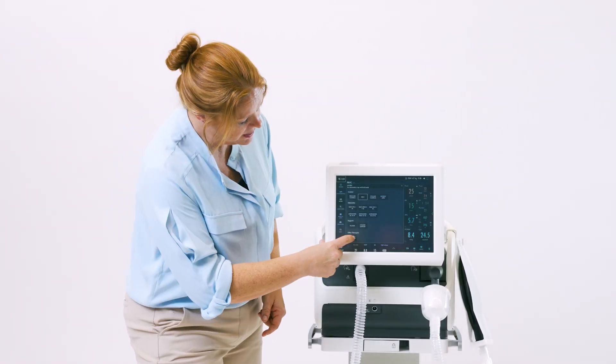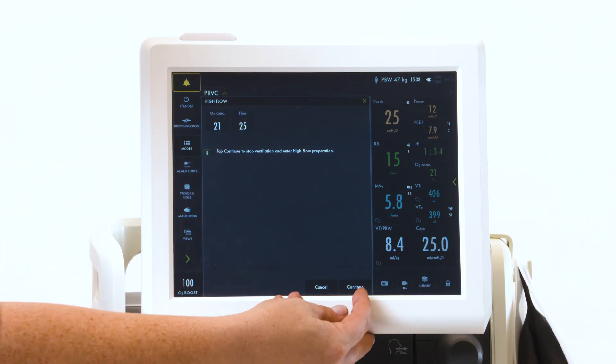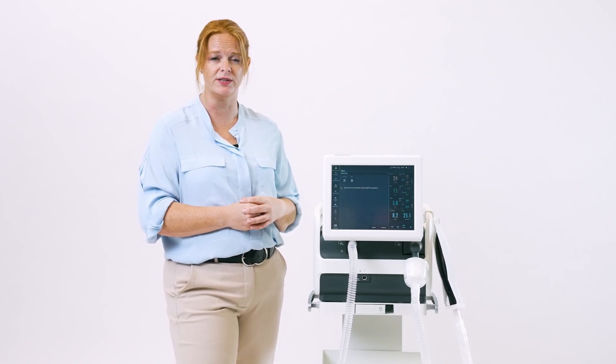High Flow is located at the bottom of the screen. Touch and your settings will come up. Cancel and Continue are down here. Remember, if you touch Continue, it does stop ventilation to go into High Flow Therapy.